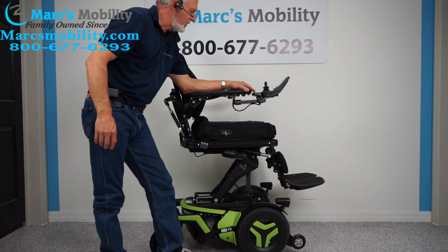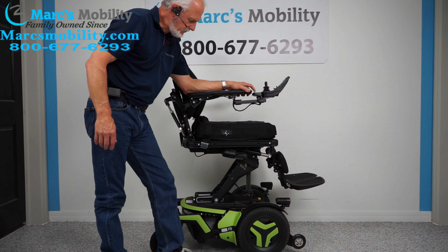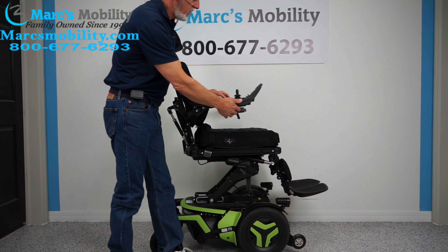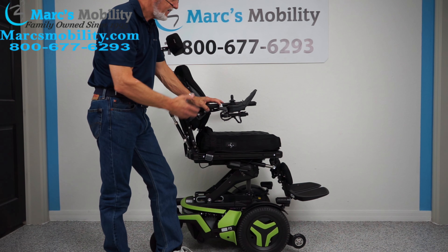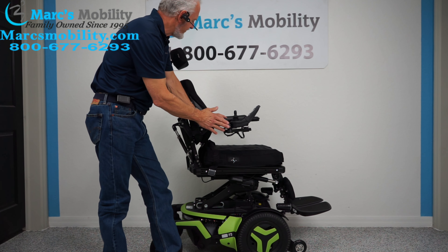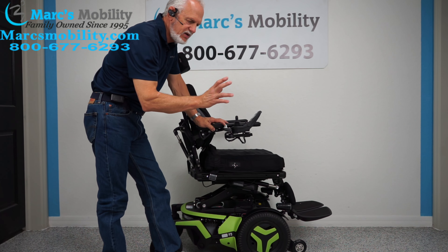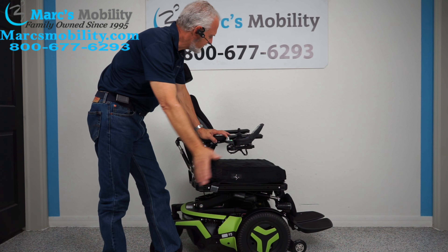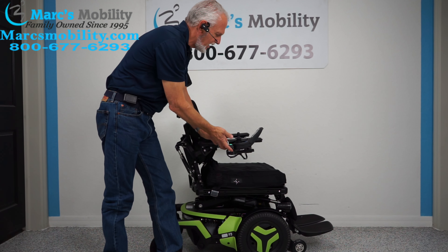The next function I'm going to show is going to be the electric tilt. Before we do that, let's get the seat down first. This is called a swing-away joystick, which enables you to get closer to a dining table — very nice to have. Everything is set up for a right-handed person. If you're left-handed, no problem — we can switch everything to the left side.